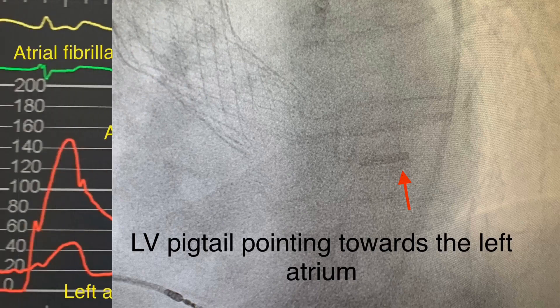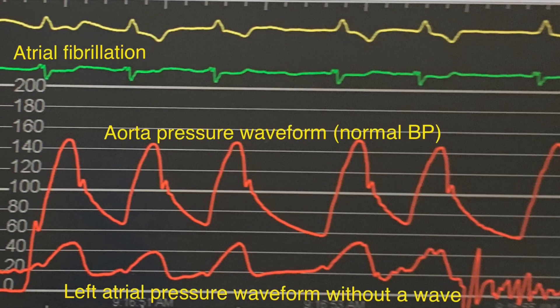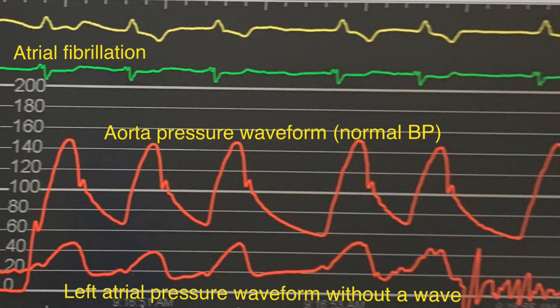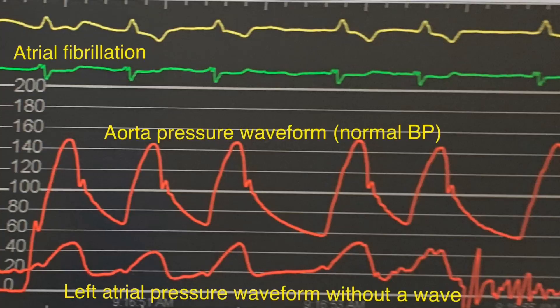And to confirm that, going back to the tracing, adding the aortic pressure waveform showing normal blood pressure, the LA pressure waveform is actually similar to atrial waveforms but lacking the A wave because the patient was in atrial fibrillation, which made it a little bit tricky to identify.